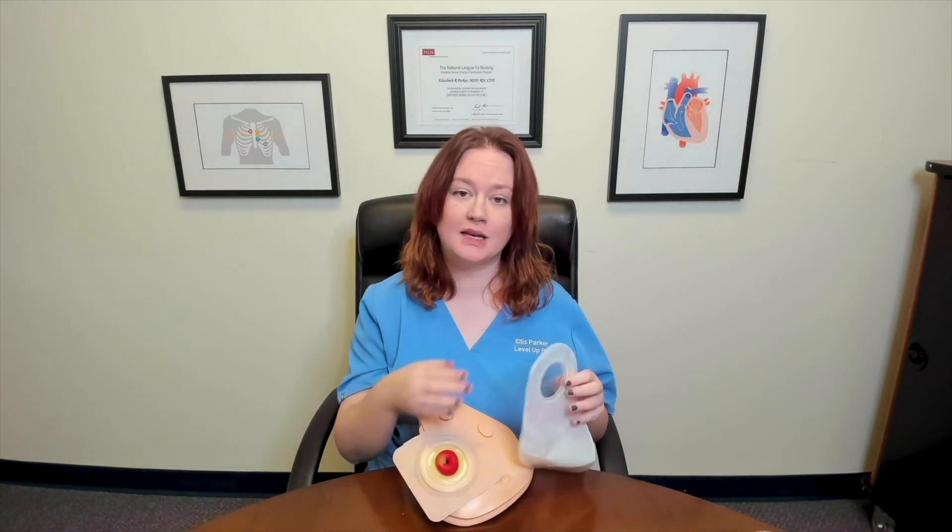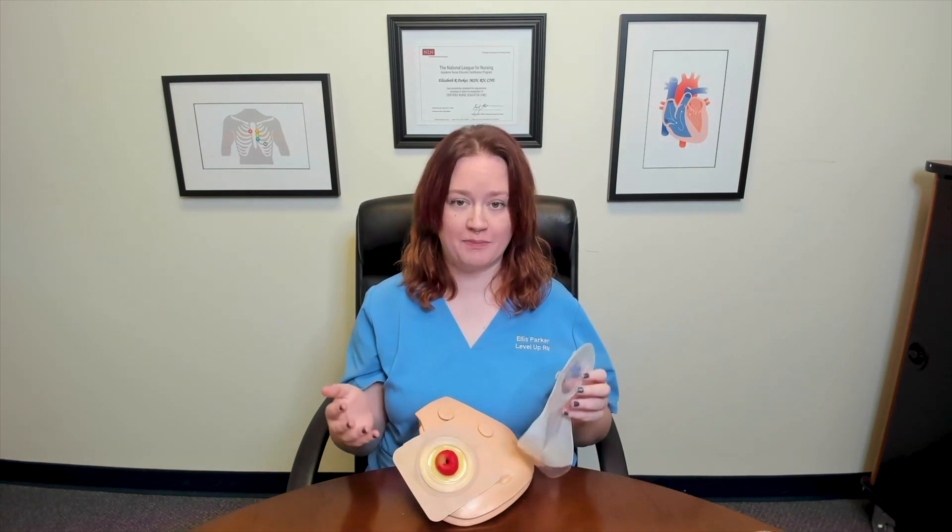During that demonstration, I showed you how to measure, cut, and apply the wafer and then how to apply the bag onto a wafer for the two-part systems. However, when I showed you how to apply the bag, I matched my rings up and pushed down because that's how it's always been demonstrated to me.